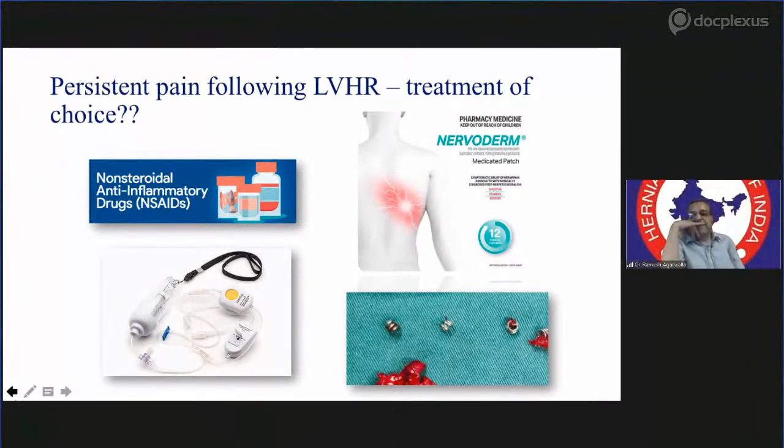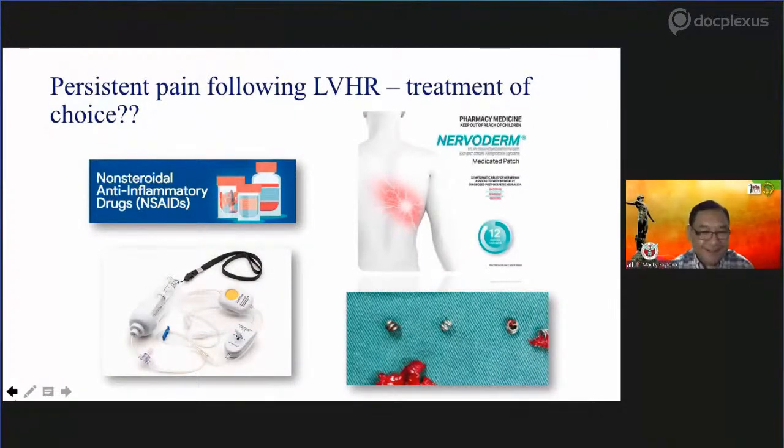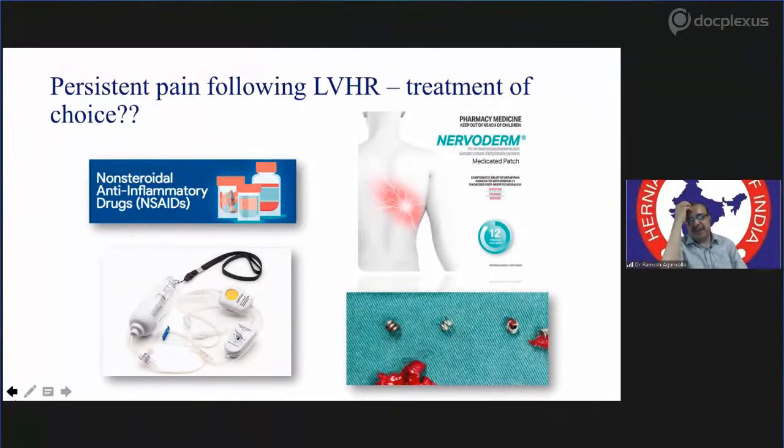What do the other panelists say? Yeah, old saying, seeing is believing. I totally agree. What is the president's opinion here? No, I think you should measure it intraperitoneally, as Avinash said, by reducing the intraperitoneal pressure. And I think that's the way forward. Also, as you know, it is not always a square or a circle. You have to measure in two places, longitudinally and transversely, and get an idea. That's what I personally feel.